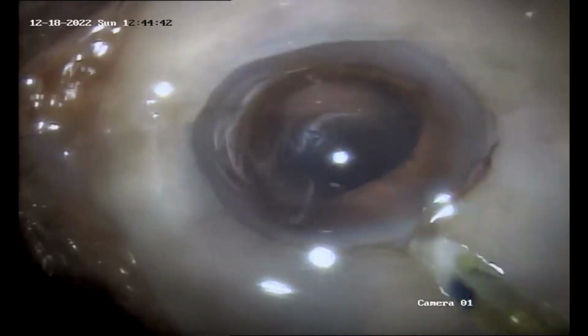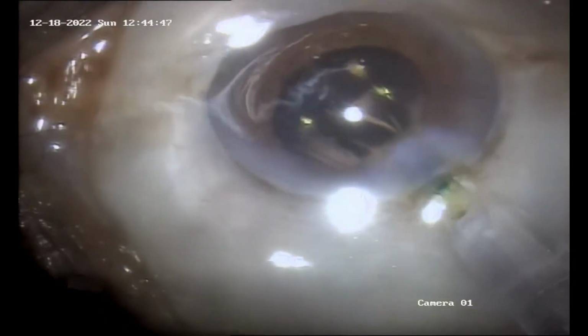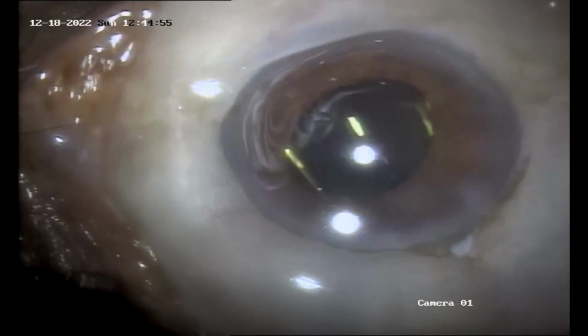A foldable hydrophobic IQ intraocular lens is being implanted in the bag in presence of OVD dispersive.